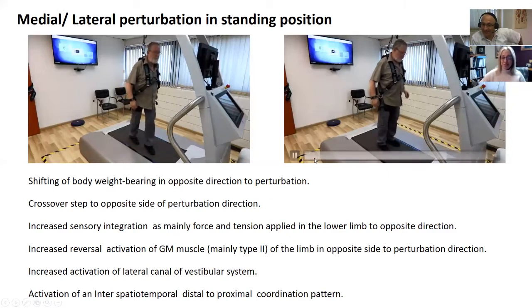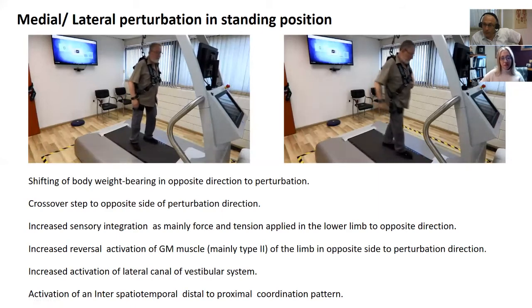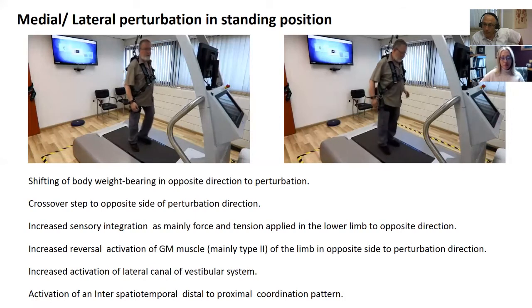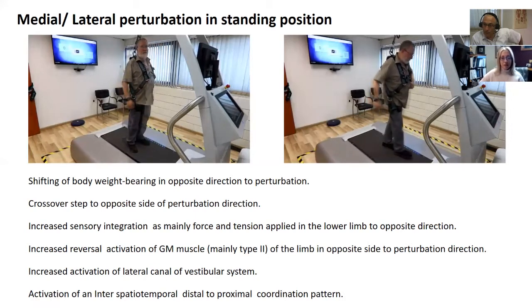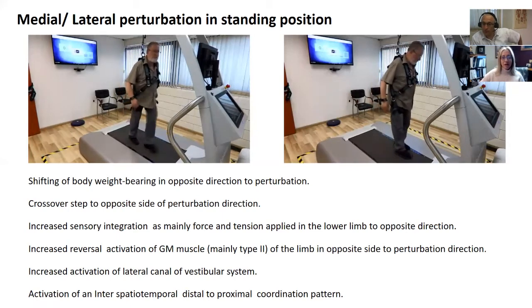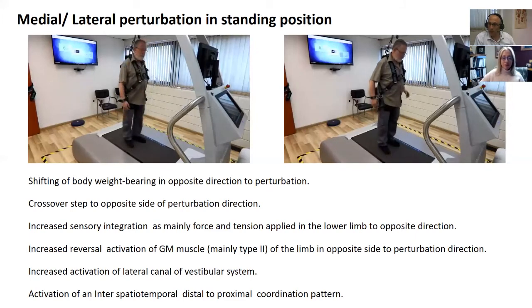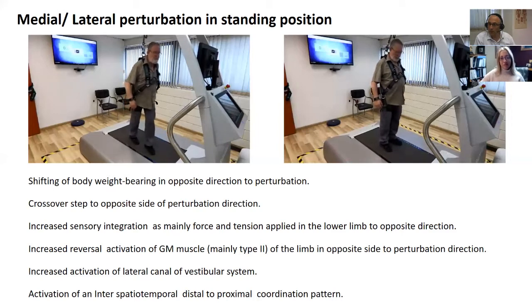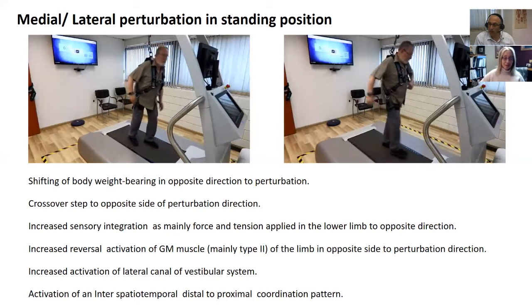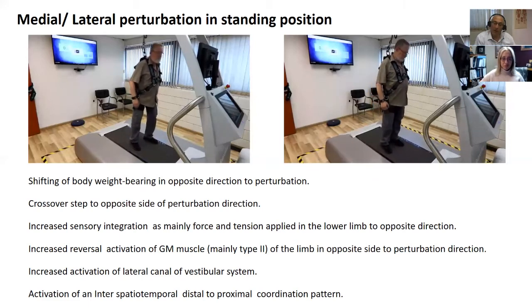Correct. So right, and the fact that it can be repetitive, so we can repeat that same perturbation and elicit the same response, if not perhaps a little bit better over time. So that's exciting too, that a lot of times as therapists, we want to go forward and backwards right away, or anterior, posterior. However, this man clearly needs work on that right stance leg, so to speak. It's great. That's right. So yeah, those points are very welcome.